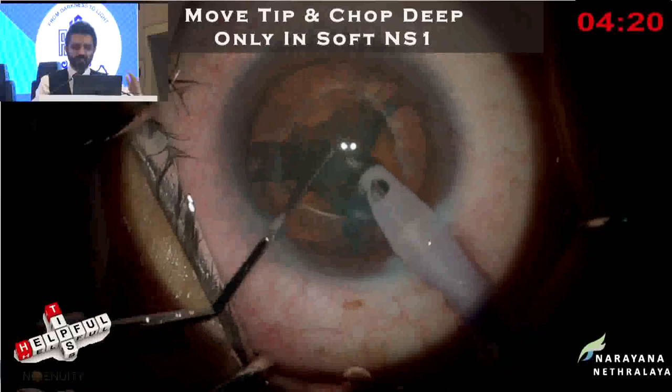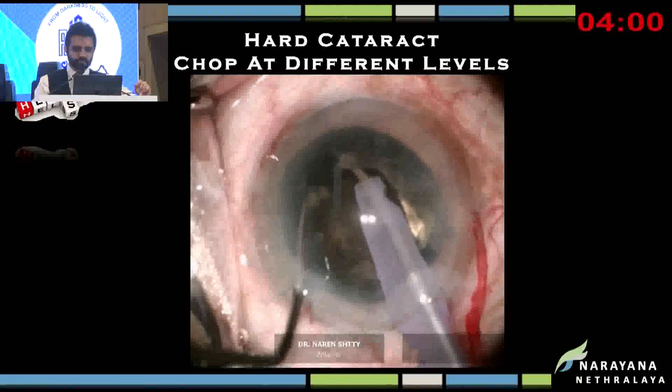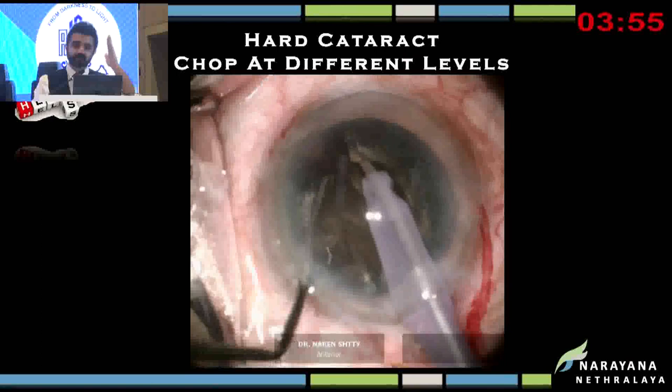Now, what about in very hard cataracts? See, separation is very important. As you can see, when you separate these pieces, first you separate the superficial layer, then you release, take the dialer more deeper, then separate, then release, go deeper and separate. So let's have a look. See, this is a black cataract, which you can see. So initial chop, I separate the superficial layer, then take the dialer more deeper, separate, deeper, and then separate. This way you will get a complete chop through and through. Doesn't matter what the grade of cataract, it's very, very easy.